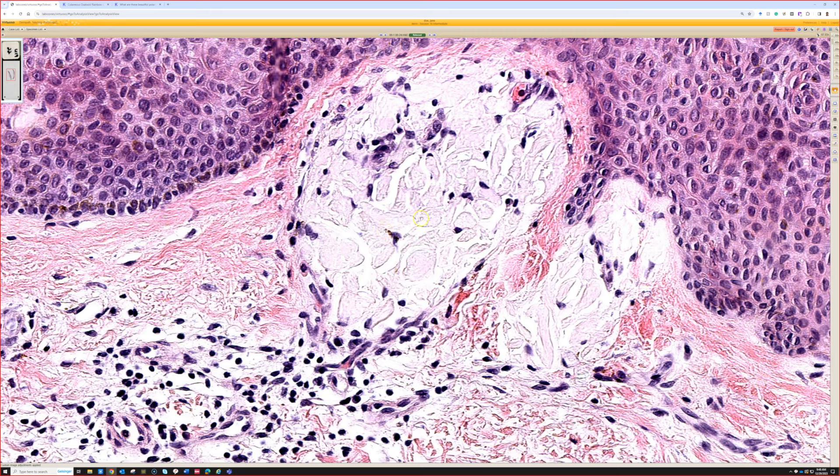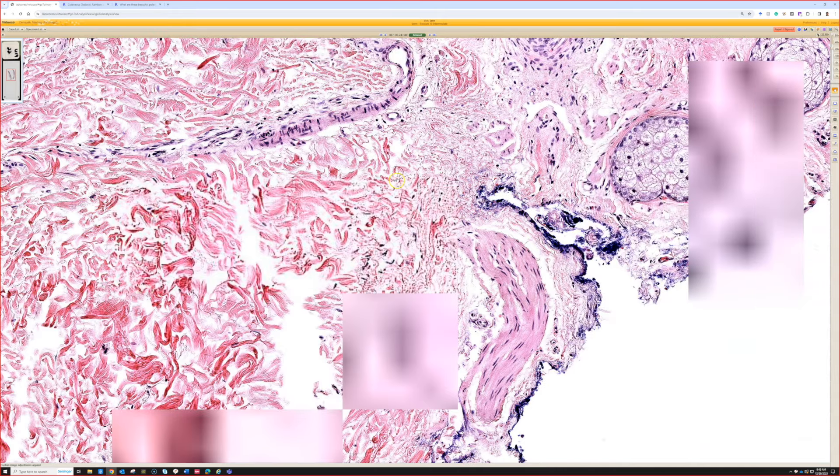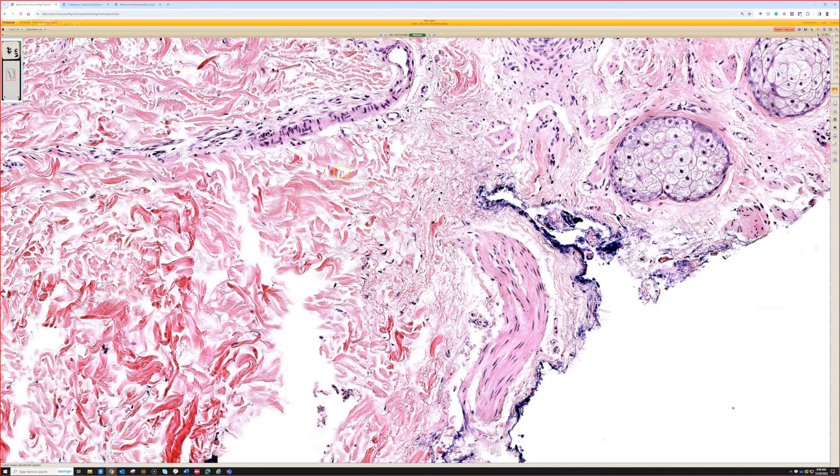If you go deeper in the dermis and look around other vessels or deeper adnexal structures, you're not going to see any amyloid deposition. If you did see that, that's when I would send it for mass spec to check whether it could be light chain amyloid incidentally depositing next to a seborrheic keratosis or basal cell. If you see amyloid around deeper dermal vessels or around eccrine coils, then you'd think maybe this actually is a patient with systemic amyloidosis.